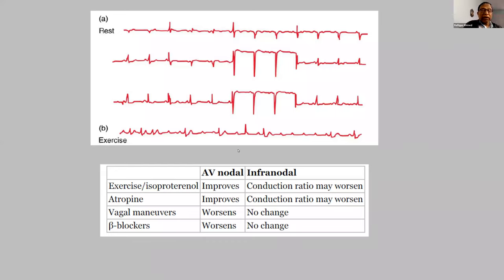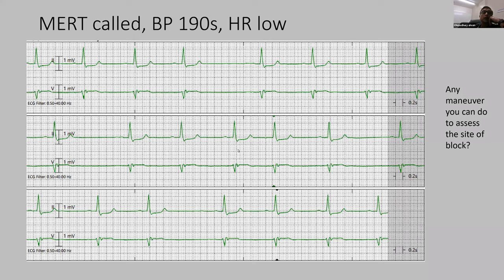Can you go back to the ECG, please? The bradycardia. So what time was it? In the middle of the night. Okay, and the patient was lying, sleeping happily, right? Not sleeping. Patient is awake. Because of the gallbladder, patient was having some pain in the belly. Okay, and that might activate vagal tone.